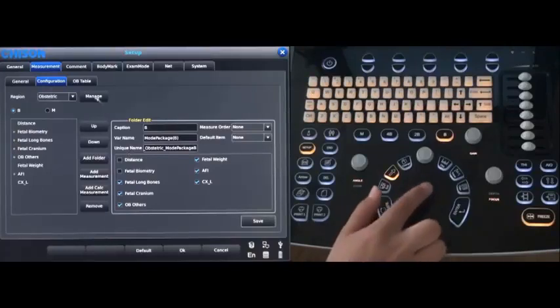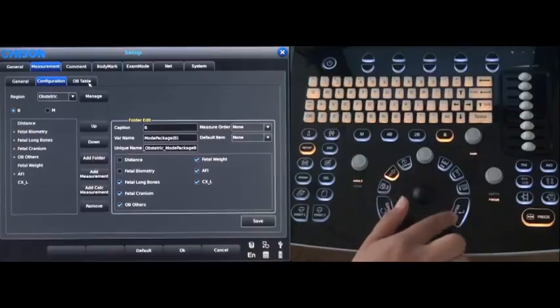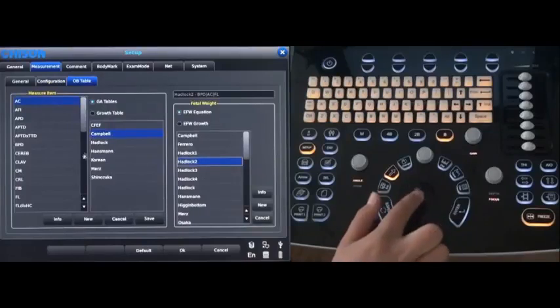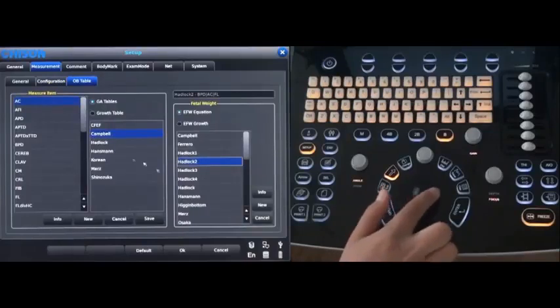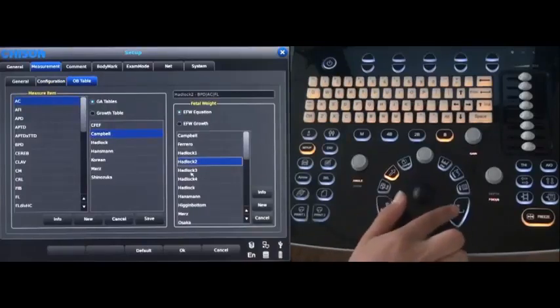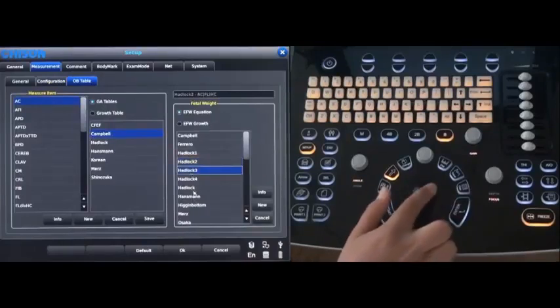Then go to OB table. We have a lot of choice for you, even for the fetal weight.